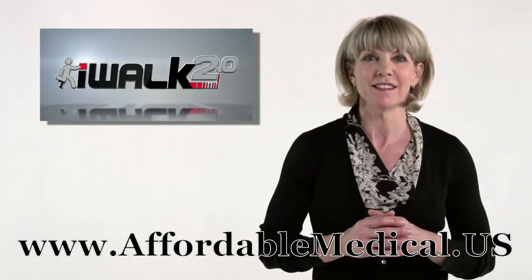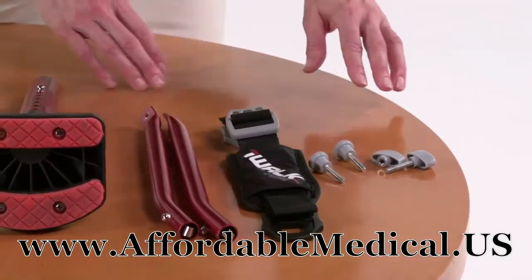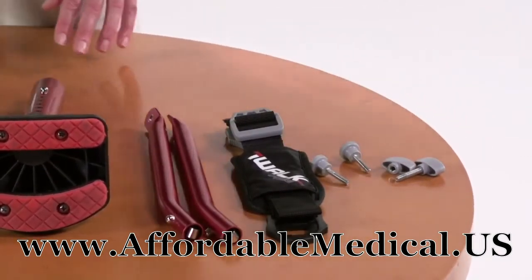There are only a few more parts to the iWalk. These two support tubes, and inside the bag you'll find a third strap, a couple of thumb screws, and a clamp knob and bolts.